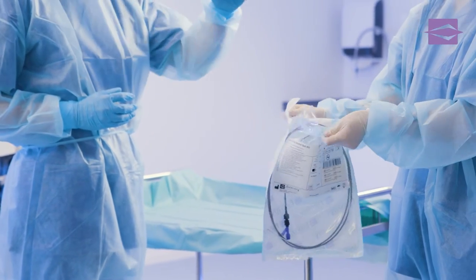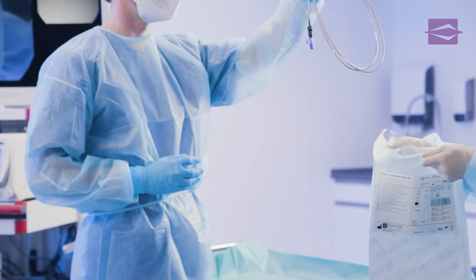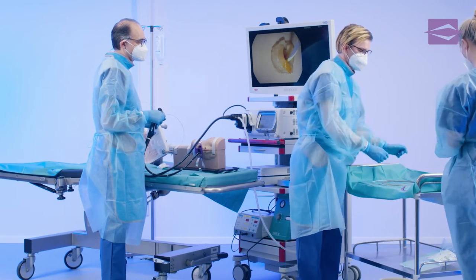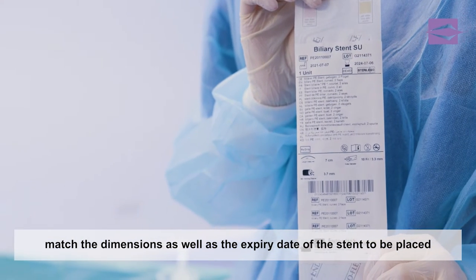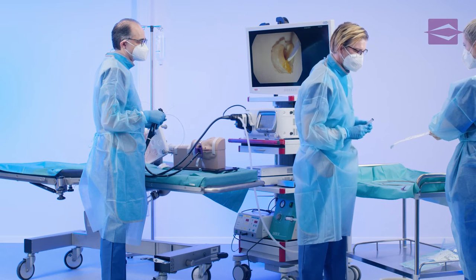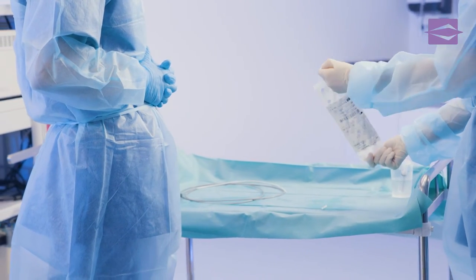The assistant removes the unloaded set from the sterile packaging and places it on the sterile tray. The biliary stent to be implanted is provided, and the stent with its integrated positioning sleeve is also positioned on the tray table for later loading of the placement set.